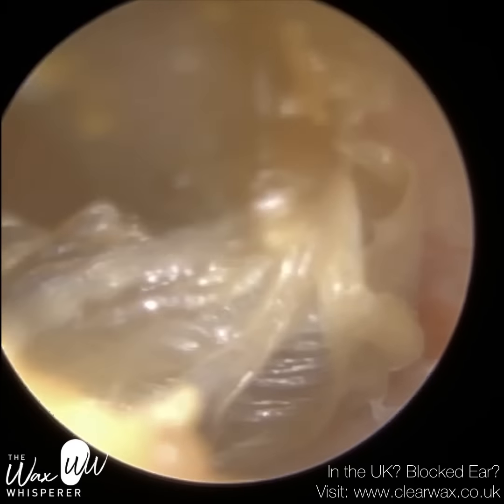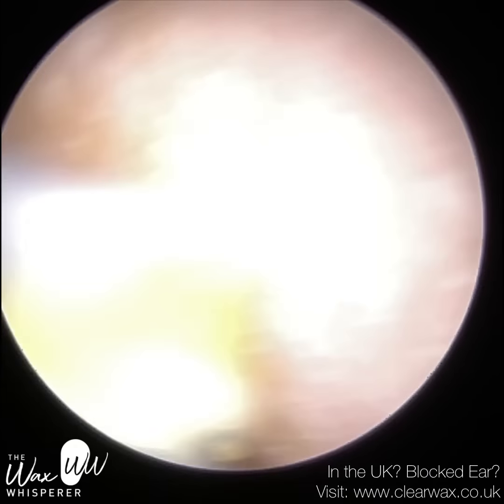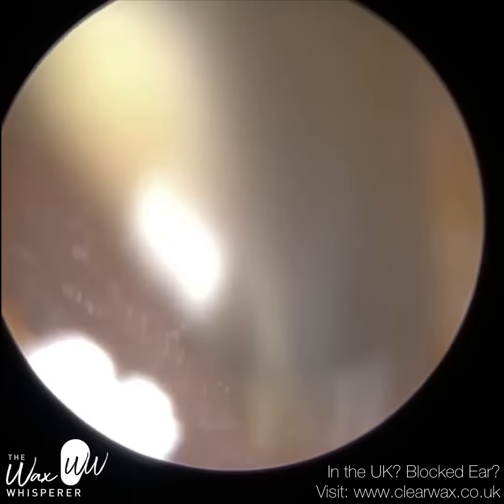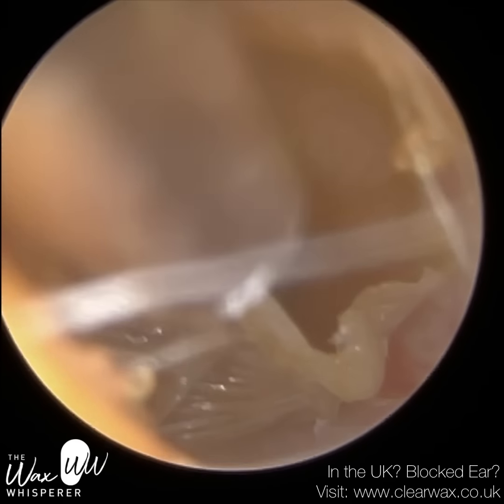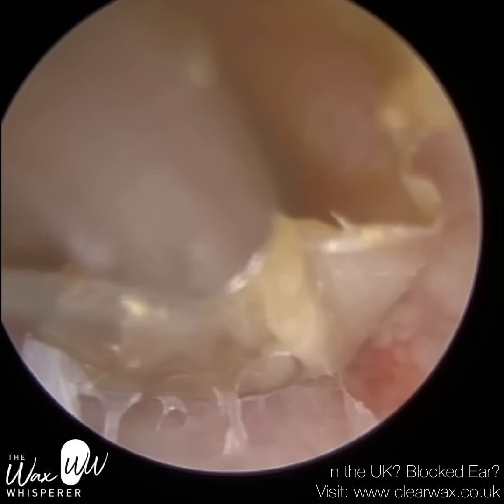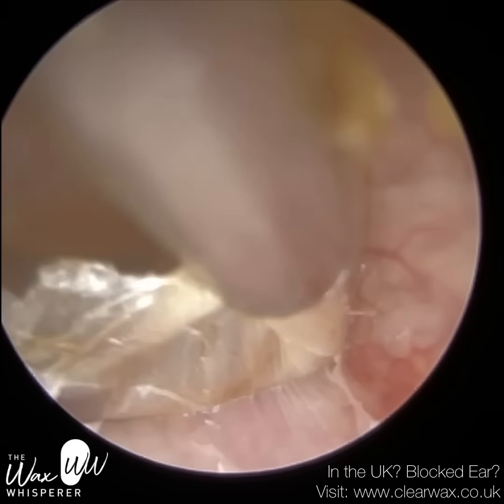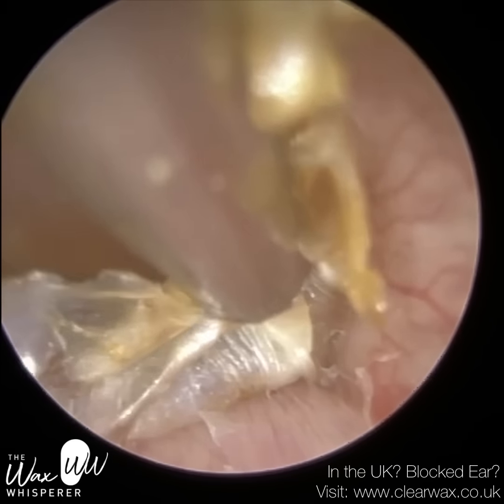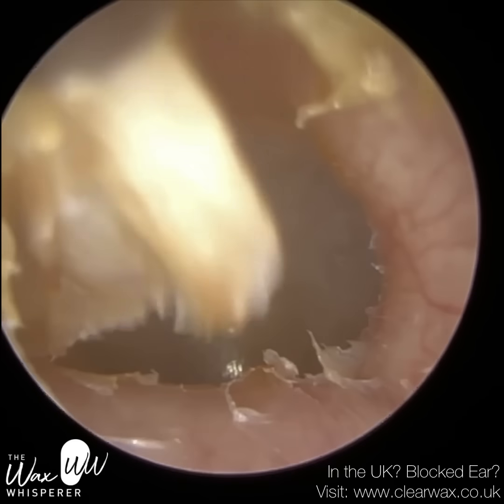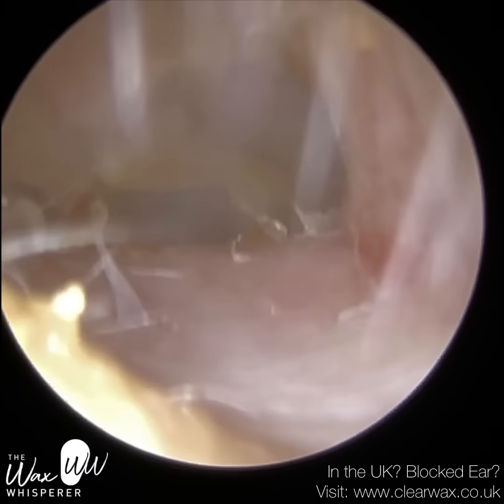This skin removal isn't going to improve the patient's hearing — the occlusion had already been cleared. However, this skin is very unlikely to migrate on its own. Typically, dead skin in the ear, as it dies and sheds, moves sideways like a conveyor belt out of the ear and is replaced by another layer of skin underneath — a continuous cycle. Our ears have developed to self-cleanse of dead skin. But it's very apparent that, given the way this skin is adhered to the canal, it's not going to come out on its own, hence why I'm trying to remove as much as possible.